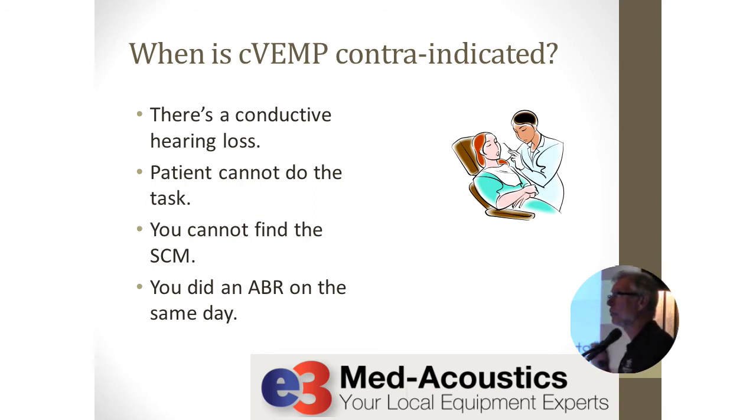I have some patients where you can't find their SCM on their neck, right? Are you turning your head? Look at your shoulder. That's the best instruction. And you can't even see this. You're taking a guess where it is. Well, very high possibility of a false positive on that, right? So that might be one. And then I put this last one in there. You did an ABR on the same day. A lot of clinics, this is another test that there's no CPT code for.